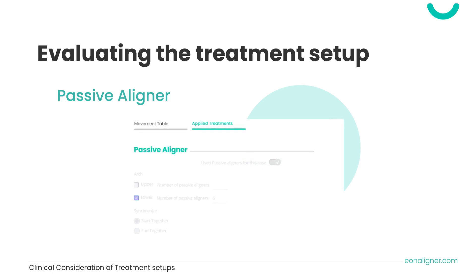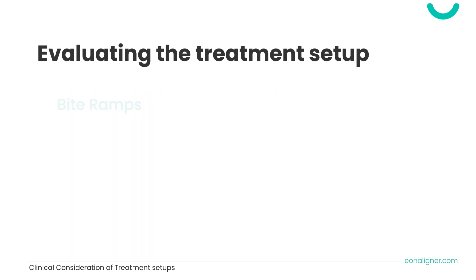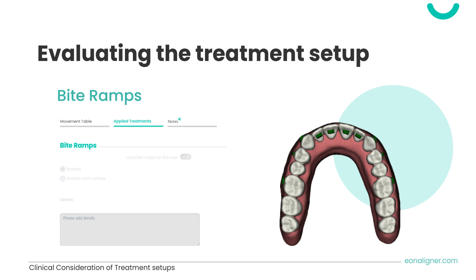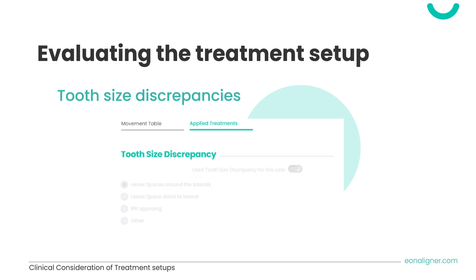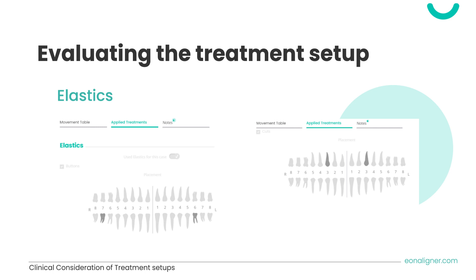Check that any passive aligners requested are applied to the correct arch and properly timed. In some cases, bite ramps are used in deep bite treatment to assist in intrusion of lower anterior teeth — assess their location and confirm lower incisors are in contact to ensure their function. In cases with tooth size discrepancy, verify that the amount of space left is appropriate or that IPR on the opposing arch addresses the discrepancy. For elastics, check that hooks and cutouts are in the right places, attachments are appropriately placed to avoid interferences, and timing is correct.